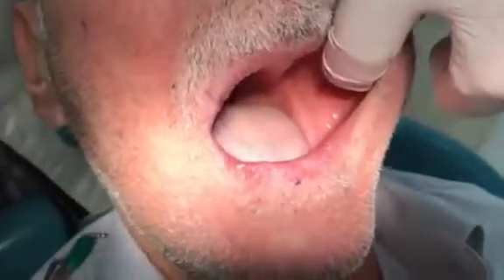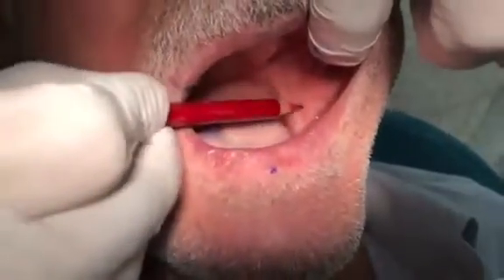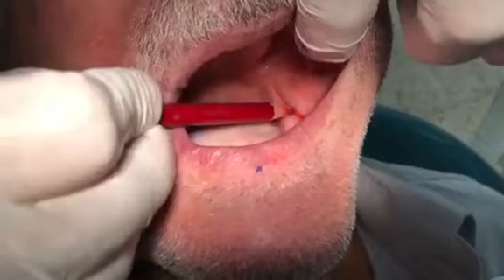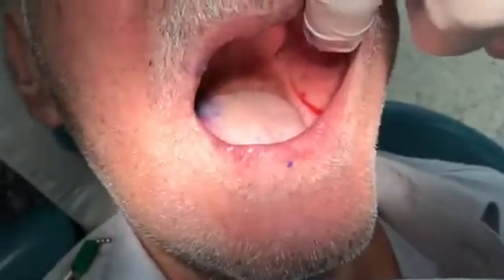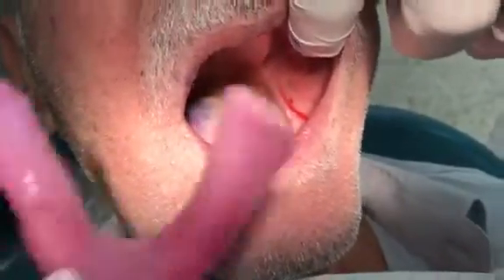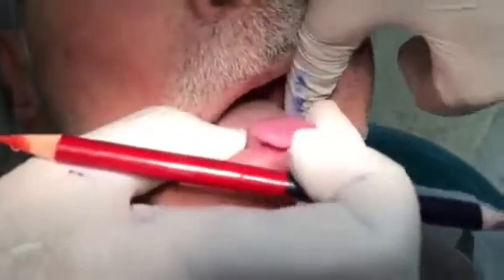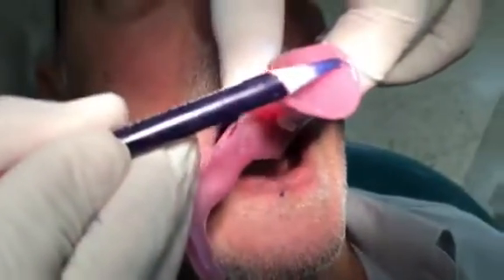Look at the masseteric area — this is the masseteric area. See how the masseter is attached very close to the ridge. So if I enter with this, go inside, imprint that line, and take it out from the denture, I find that this is our line.